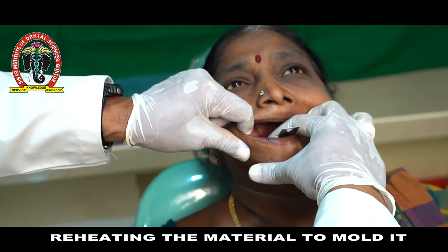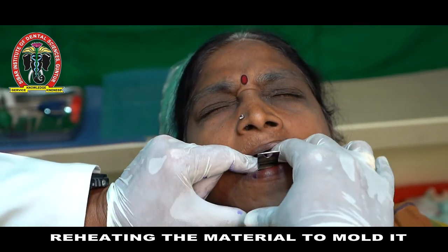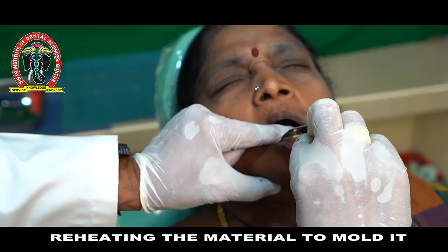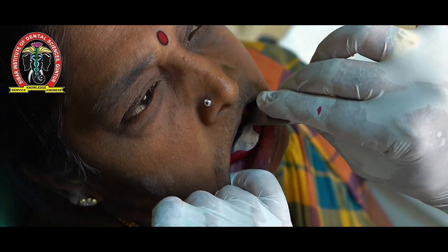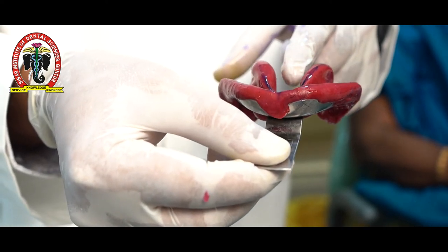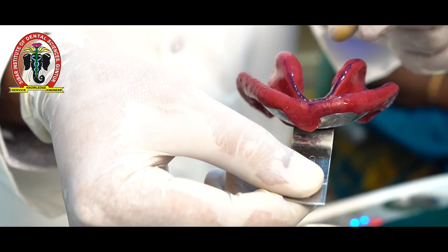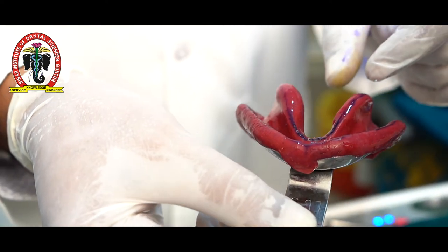To refine the buccal flange, bring it outward, upward, inward, anterior and posterior. To refine the labial flange, fold the lip and move it upward. The thickness of the border is reduced — cut the excess material all around. Use the blowtorch or alcohol torch to soften the material and refine the borders, then once again perform the necessary movements in the patient's mouth.